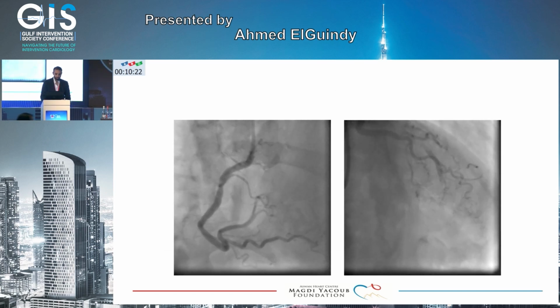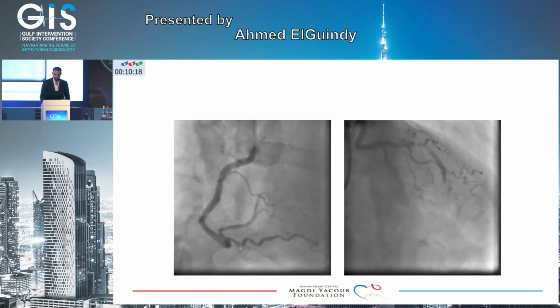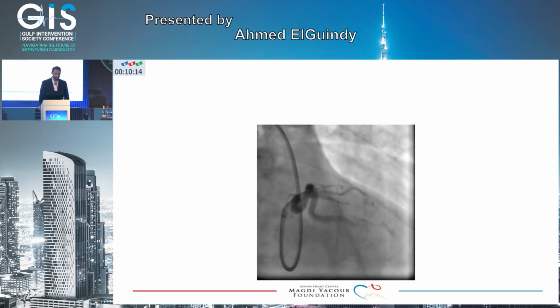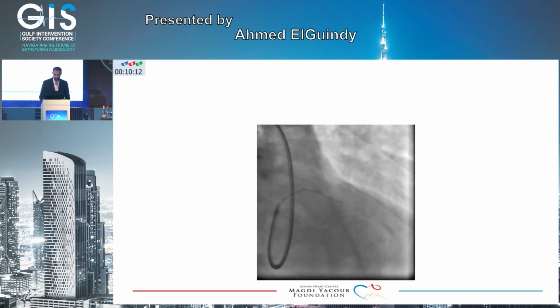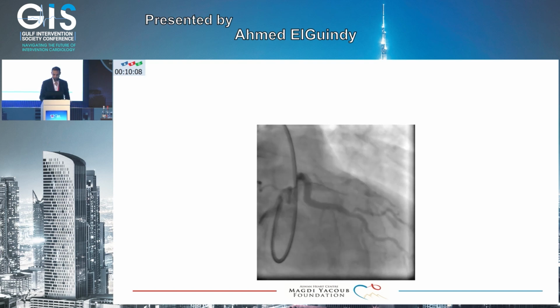So this is an example of how you would walk into a non-CTO PCI program, an LAD, a short segment, an operator trying with a Fielder XT without the support of a microcatheter, and you can clearly see that this is stuck in the extraplaque space.